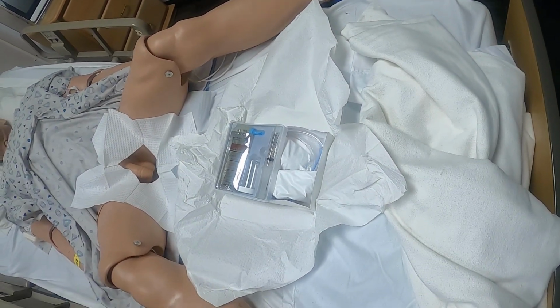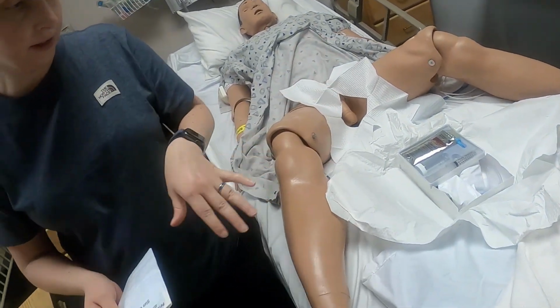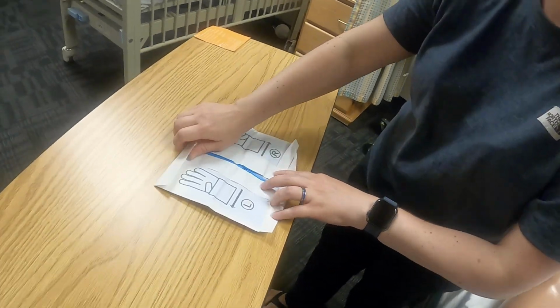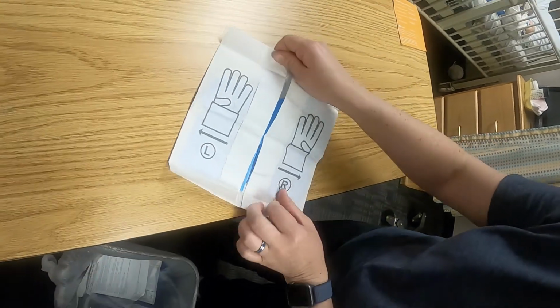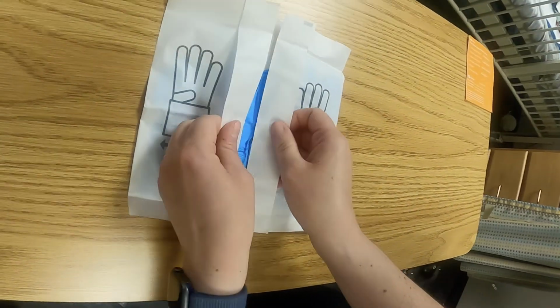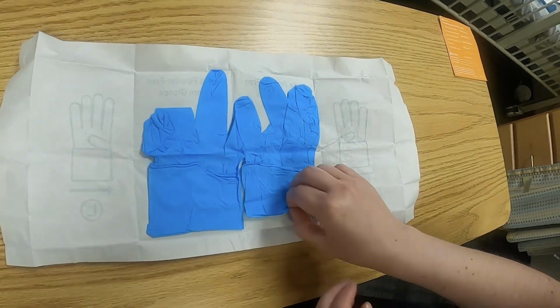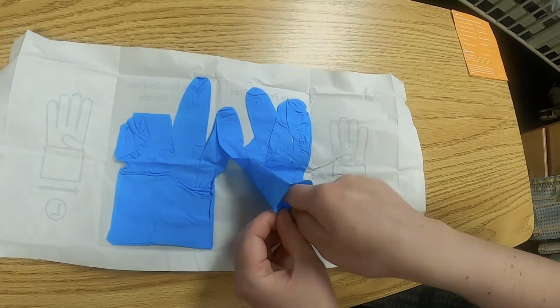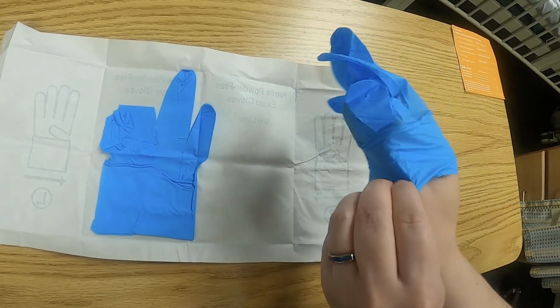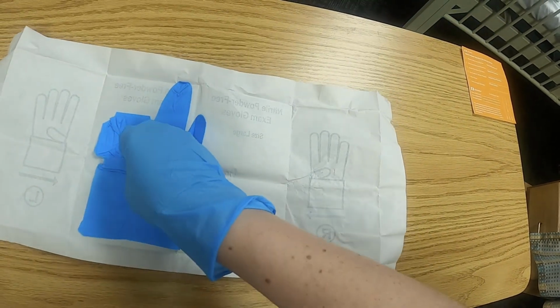All right. Now I'm going to put on my sterile gloves because everything else in there is sterile and I don't want to go flipping flopping over back and forth. If I'm going to put on my sterile gloves, it tells me exactly which one is left and which one is right. I'm opening them up like that. Open up the stuff with intention. Okay, first things first. So this one here is right. There we go. And now I go inside of the cuff.